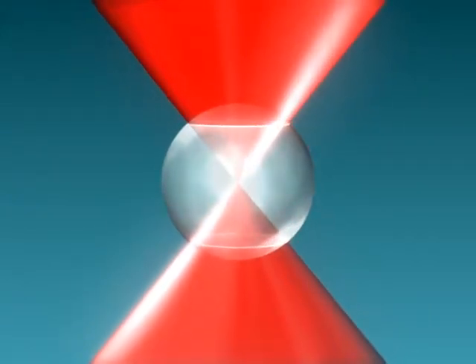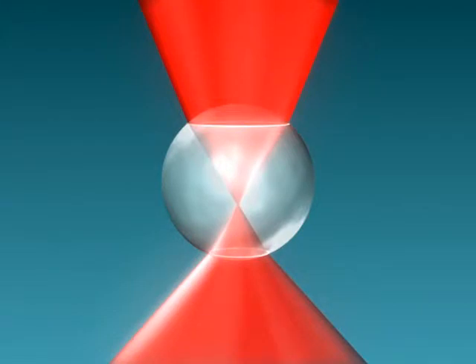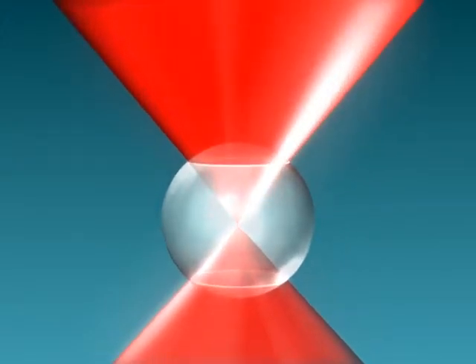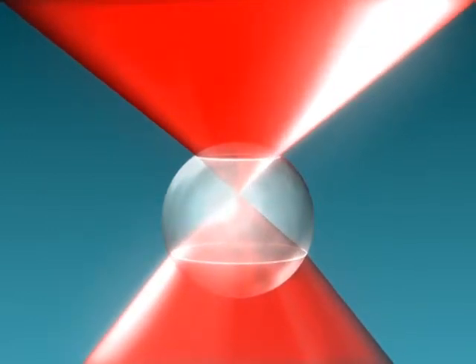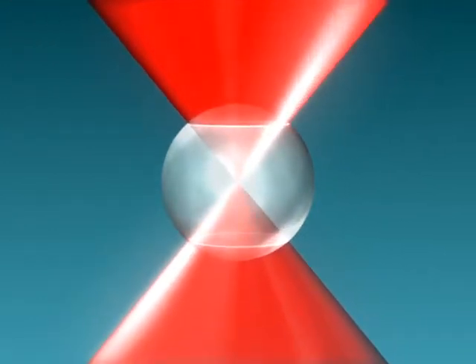If the beam is focused at the bottom of the microsphere, the light is lensed forward. The microsphere pulls the light upward and the light pulls the microsphere downward. The microsphere moves downward to center itself on the focused laser point. If the beam is focused above the center of the microsphere, the light is lensed outward and the microsphere is pushed upward.